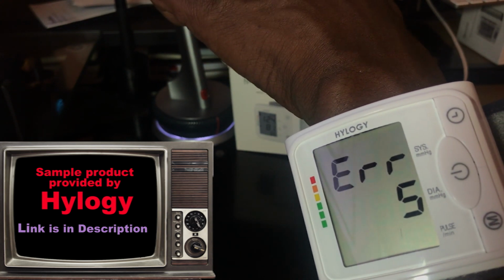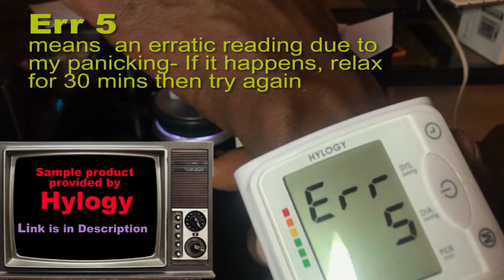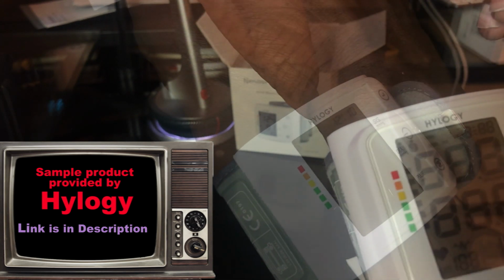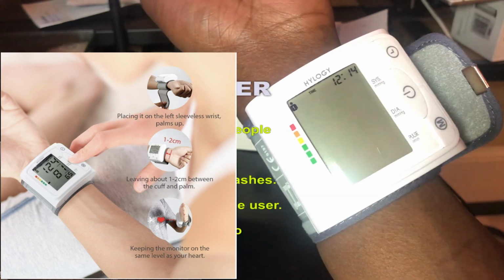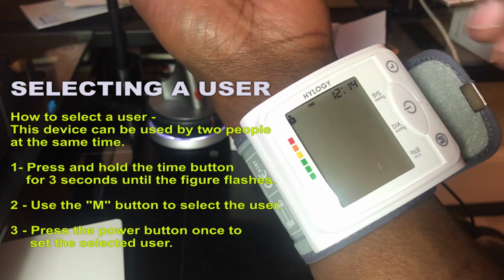So it says it recorded an error again. I'm not sure why it recorded an error. So what I'll do is I'll give it one more try. So it looks like the first mistake I made was I put it on top of my wrist instead of my inner wrist. So now we're gonna take a look at how to change the user.